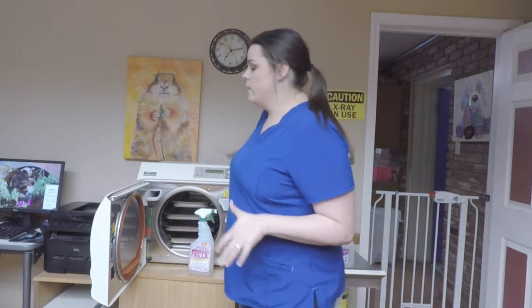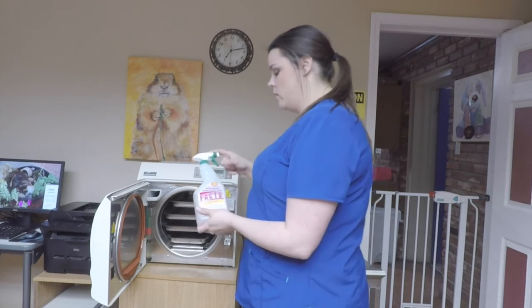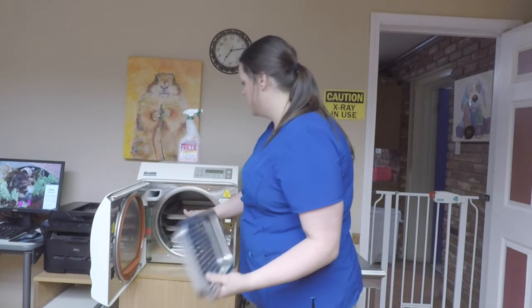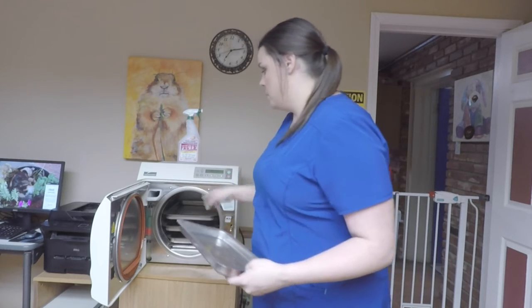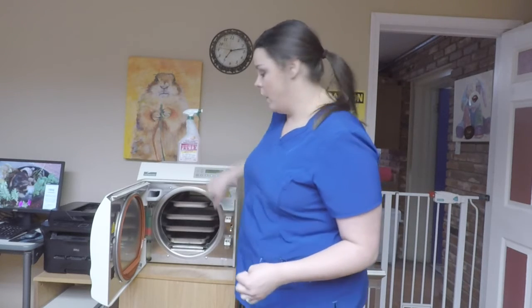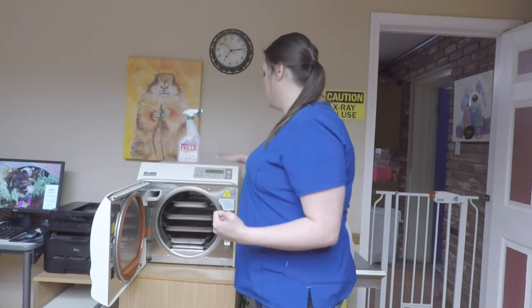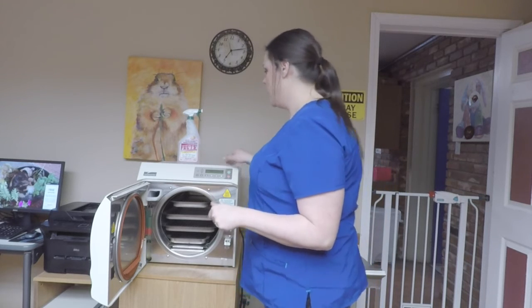How to maintain an autoclave? You need to make sure that everything stays wiped down, and then we have a foaming autoclave cleaning spray that we use. All of the trays come out. You'll spray this on the trays, let them sit for 15 minutes, and then wipe them down. And then you can put them back in. When you take out all the trays, you'll wipe down the inside of the walls of the autoclave. And then you want to make sure that you wipe this down. We wipe it down every day just to make sure that it is clean.